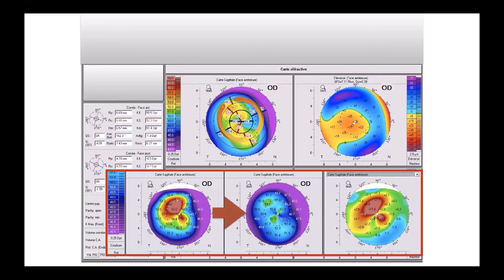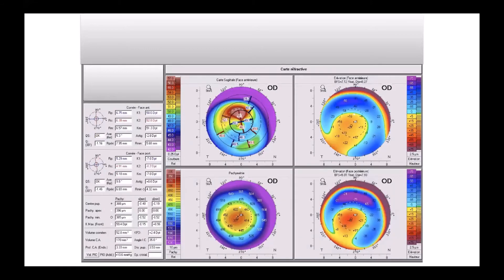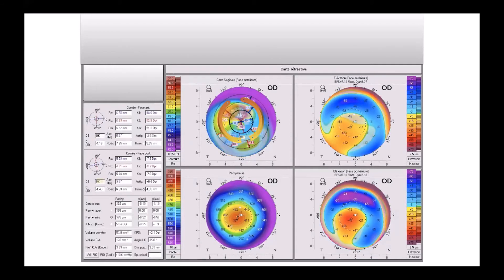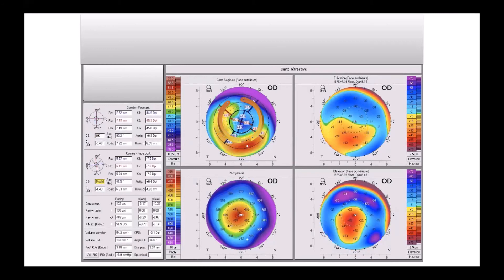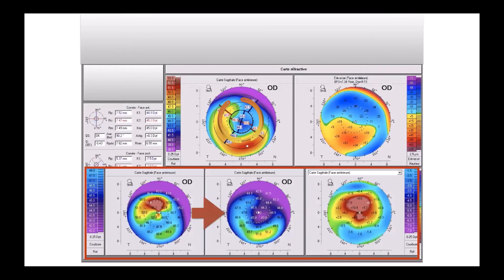These are very good examples. This is another inverted snowman with double intracorneal ring segments symmetric. Four months later: no astigmatism at about 0.3, and the differential map shows plus 10 diopters of difference, which is very good. The patient was very happy four months later.